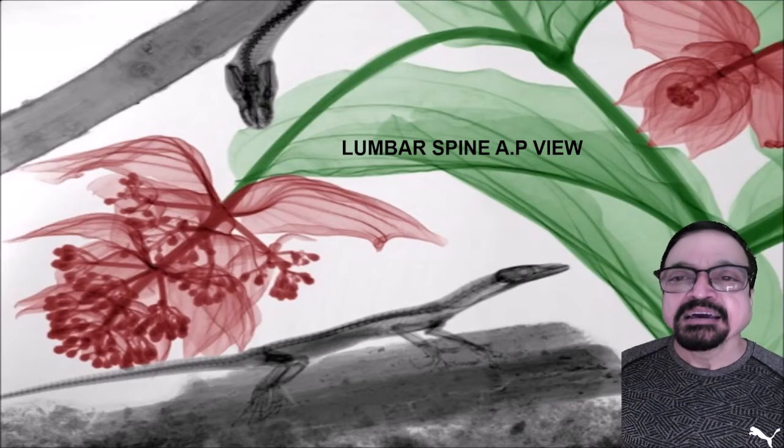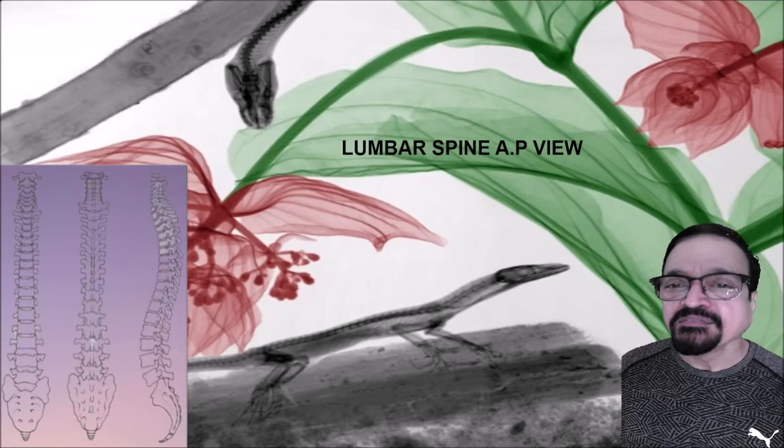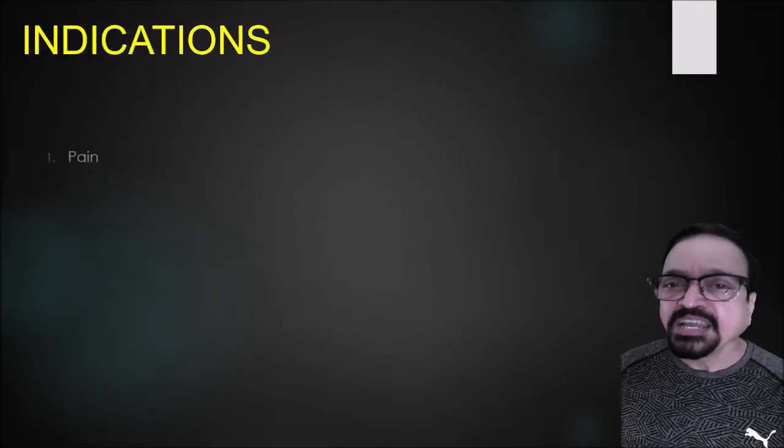Now let us go to the topic first. Lumbar spine AP is the first basic projection. For the lumbar spine, the requisition is usually for AP and lateral. So out of that, first let us see the AP.